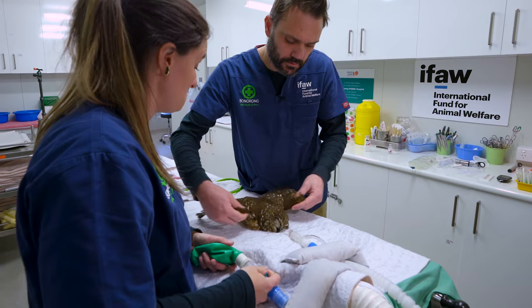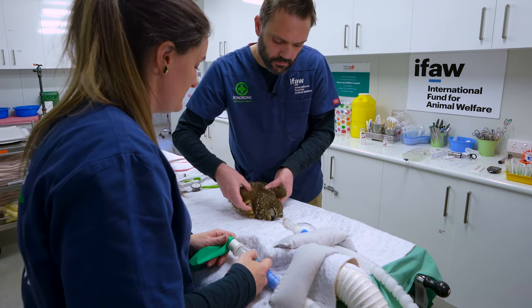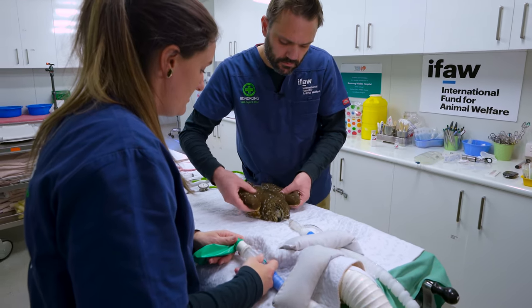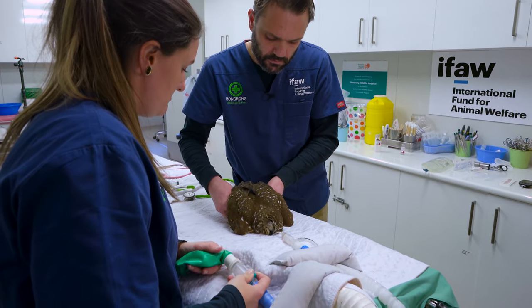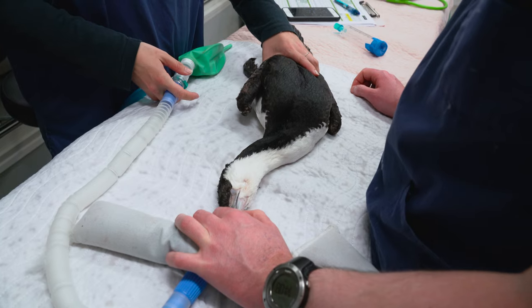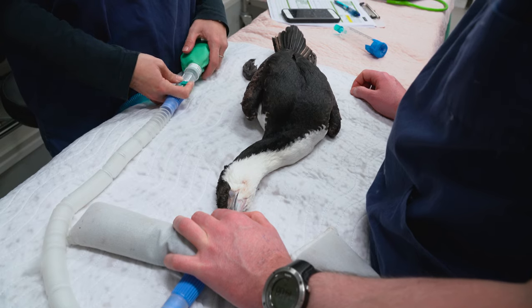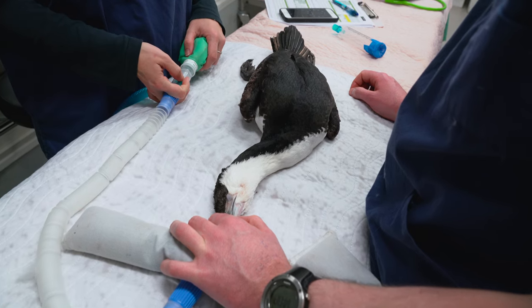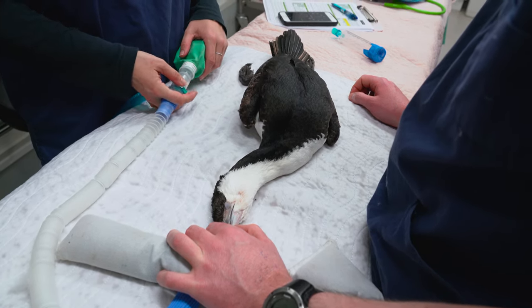Most of the time we will IPPV the birds throughout the procedure, so that if they do stop breathing, they are being breathed for that procedure — and that's not unusual to happen.